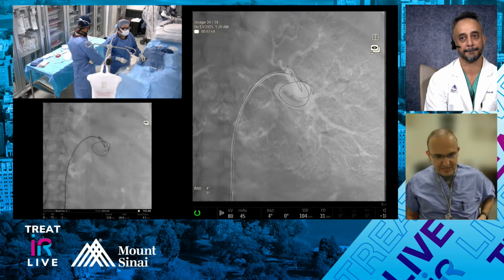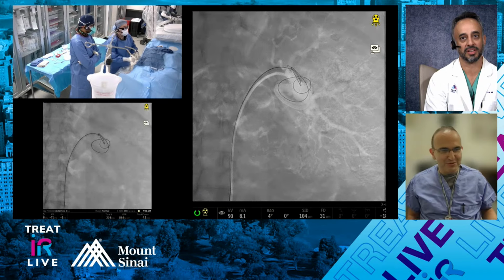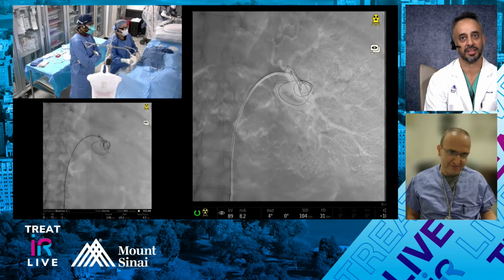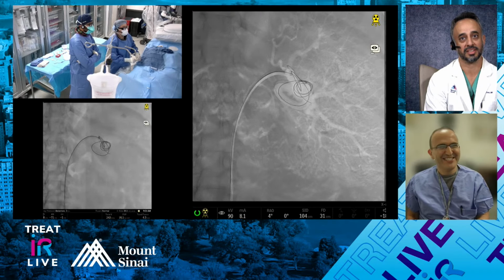Let's have a discussion. I think after the first detachable coils, why would you waste money on detachable coils afterwards? You can just probably puff in a few right after you get your framework in, right, Ed? Yeah, you could very well.